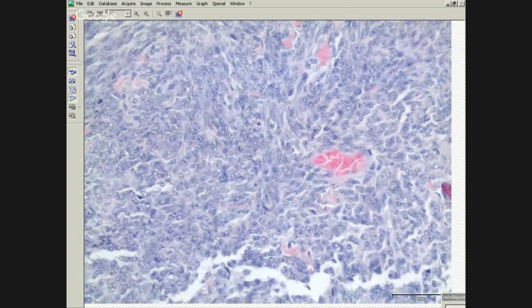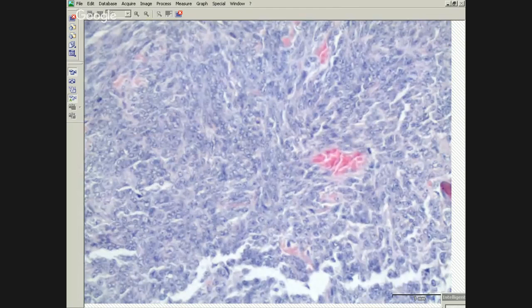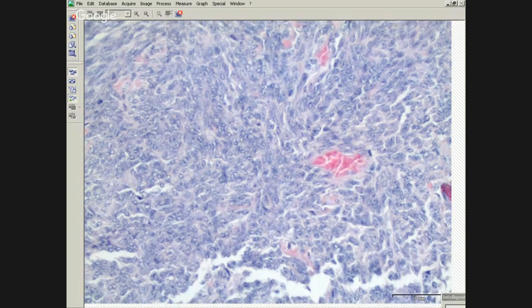Now your big pitfall with these is that a significant percentage of synovial sarcomas are going to be positive for calretinin. So you don't want to get something with a little bit of keratin and some calretinin staining and call it a mesothelioma just based on that. You want to be really careful about basing your diagnosis on one marker. You want to know the pitfalls, and other things that can occur in the location that can mimic this.